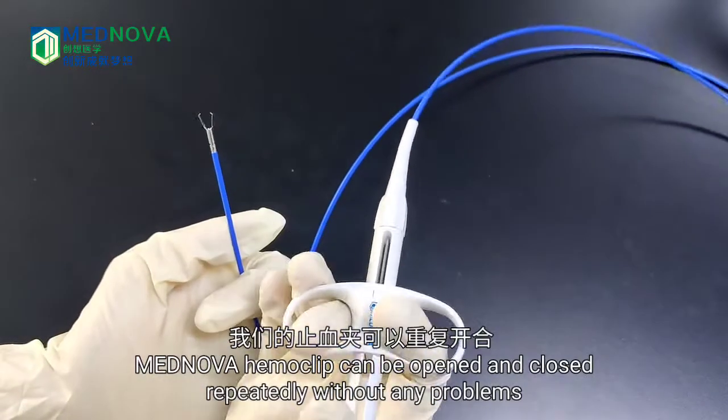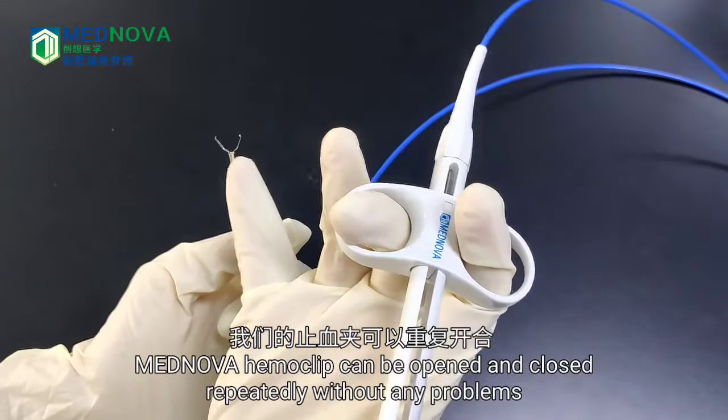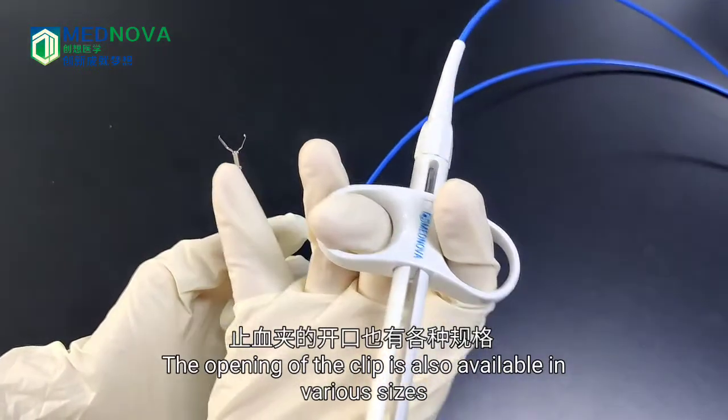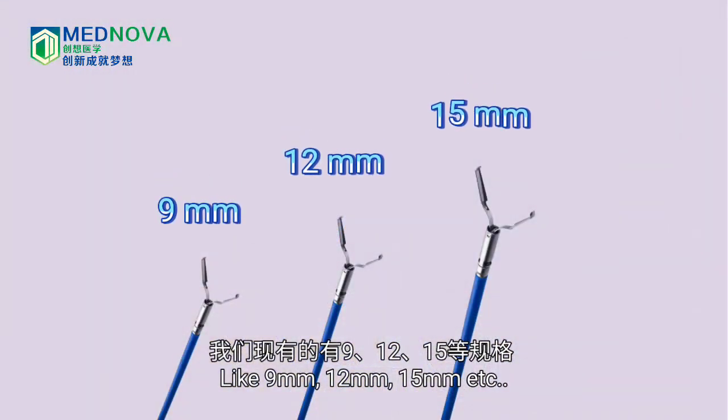MagNova Hemaclip can be opened and closed repeatedly without any problems. The opening of the clip is also available in various sizes, like 9mm, 12mm, 15mm, etc.